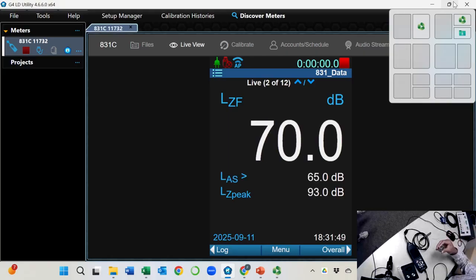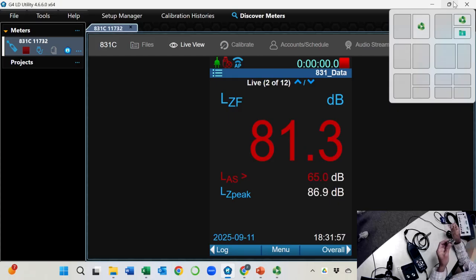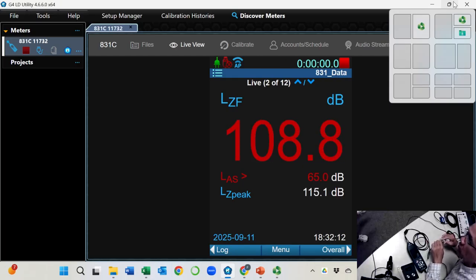And so when I use HA2, I don't need this sound tube. I don't need the ear tip sound tube. That makes the calibration better, one less device to require. Then I can just shuffle it in. And of course, I now will connect the coupler to the microphone amplifier and make sure it's all the way in. This is very important.